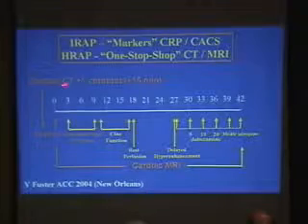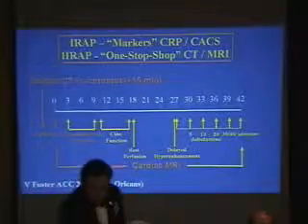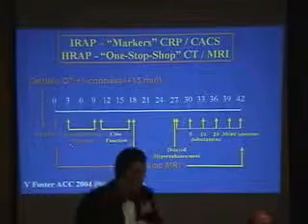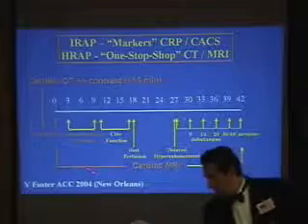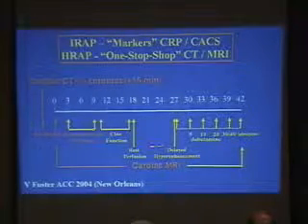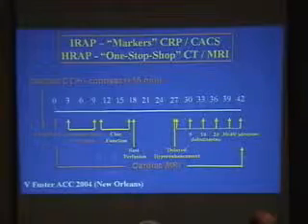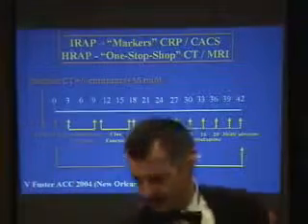Here you have CT for the coronaries. Here you have tissue characterization with MR. Here you have the adenosine stress perfusion with MR. This is really what you need in the high-risk patient. Then you have other things you can do for the patient with myocardial disease, hyperenhancement, and so forth, that is not what we are discussing today.